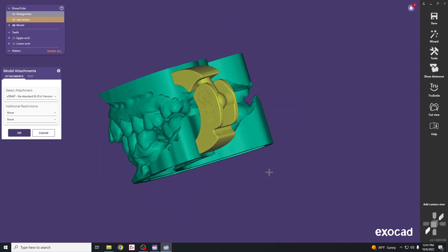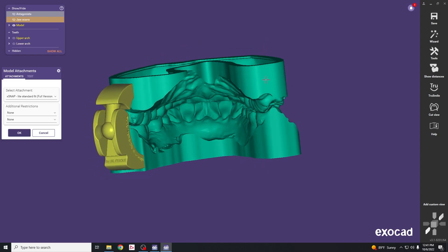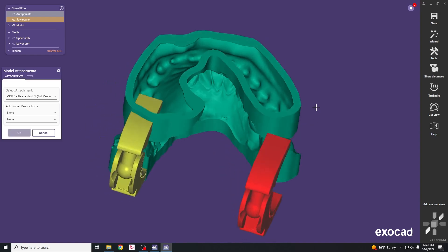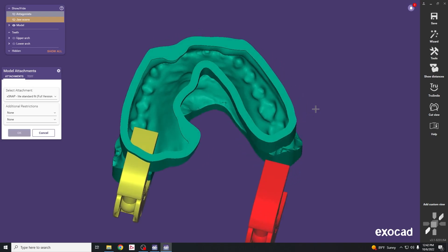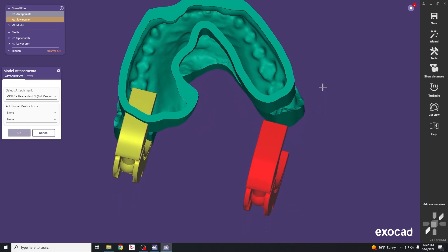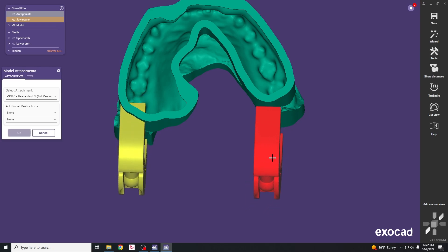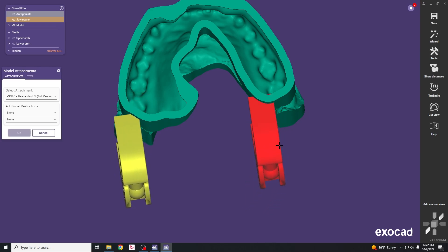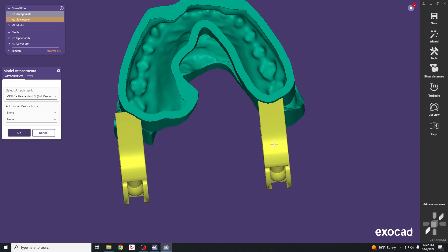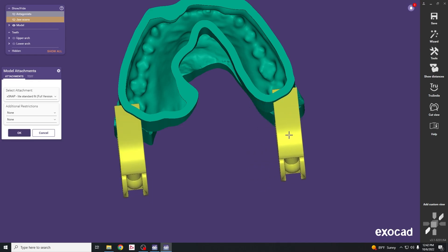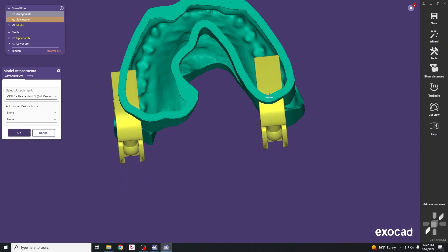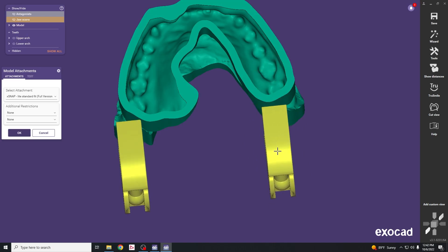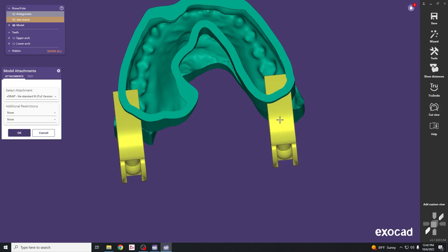Click on the other side to add a second feature. These are now linked together, meaning if you rotate with ctrl, they move both at the same time because they need to be lined up to articulate correctly. Rotate them to the right position, then left click and drag. You can move laterally independently, but moving forward or back moves both at the same time.